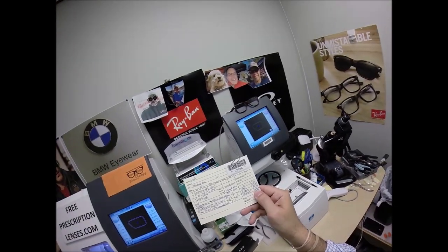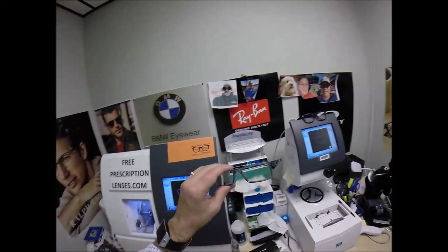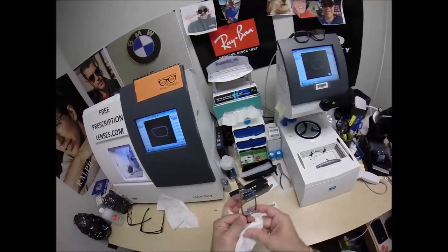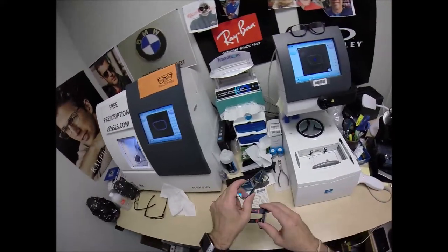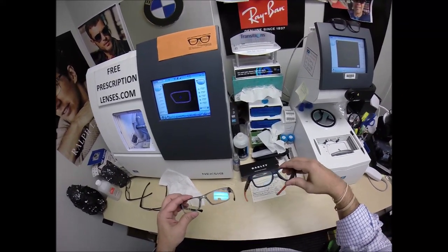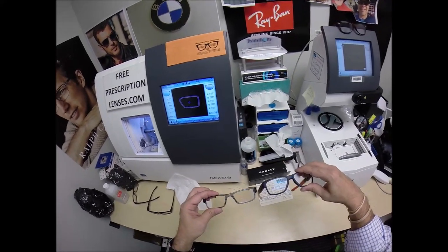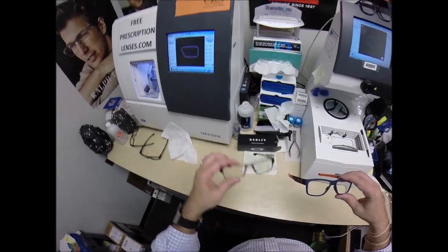And of course, the mirror coating is $69.99 for a total of $492.97. Tax-free. But this is what your lenses look like the first time. They have yet to have been activated. Now here's something I want to point out. The anti-glare, you have the blue flash mirror. I have Crizal Sapphire on mine. I have a light blue hue at certain lighting at certain angles. Yours looks like Crizal Sapphire on steroids. It just has a little bit more blue to it in certain lighting at certain angles.